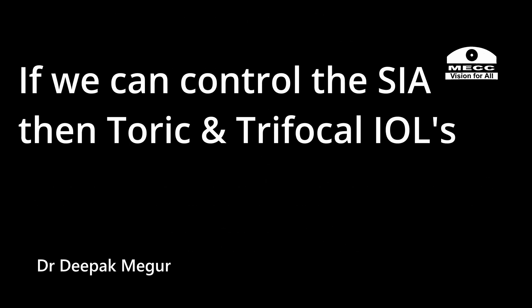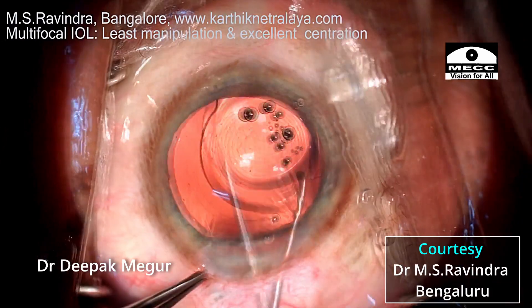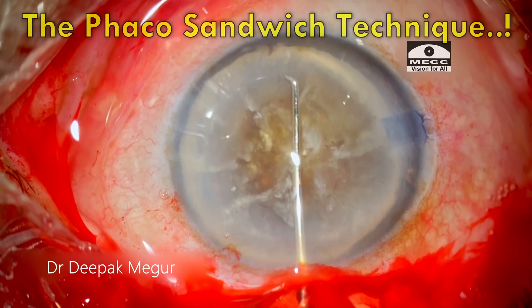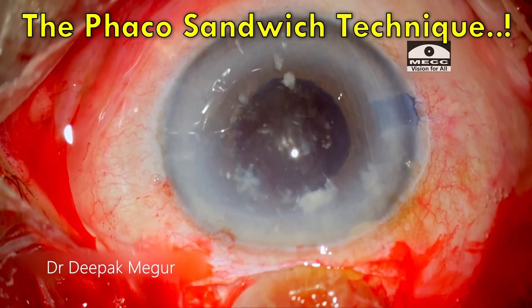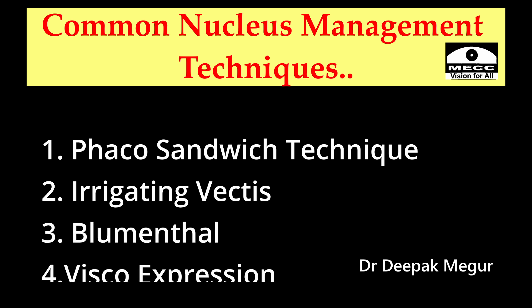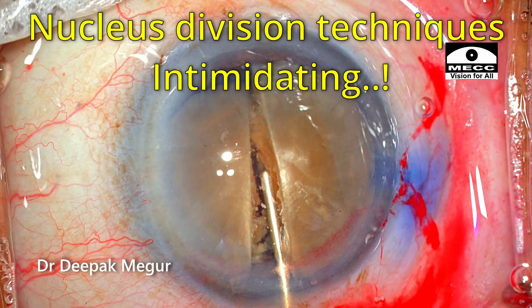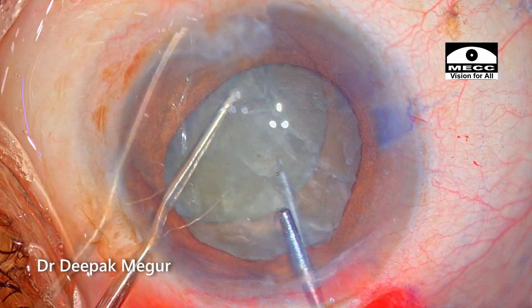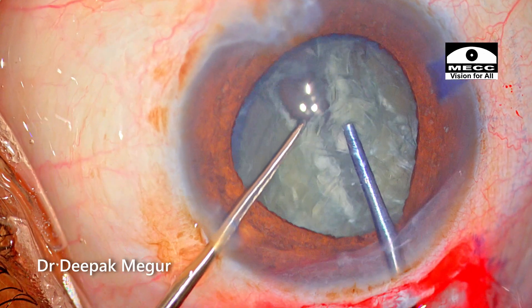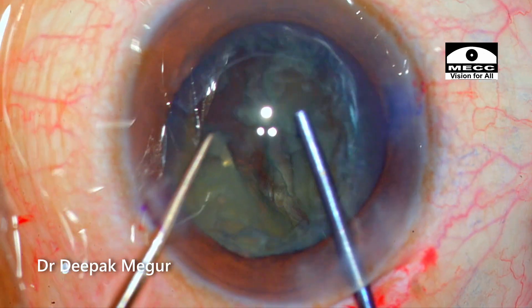If we can control the surgical induced astigmatism and make it more predictable, then manual small incision cataract surgeons can very well implant toric lenses and multifocals as well. In our country and the world over, the majority of manual SICS surgeons practice nucleus delivery without dividing it — the most common techniques being the phaco-sandwich technique, irrigation vectus technique, Blumenthal technique, visco-expression, etc. Most SICS surgeons find nucleus division techniques quite intimidating. But if we want to raise our standards and give results comparable to phacoemulsification, we cannot escape the fact that we need to learn to divide the nucleus inside the eye itself. In this series, we'll try to address some of these fears and learn these techniques in a safer way.